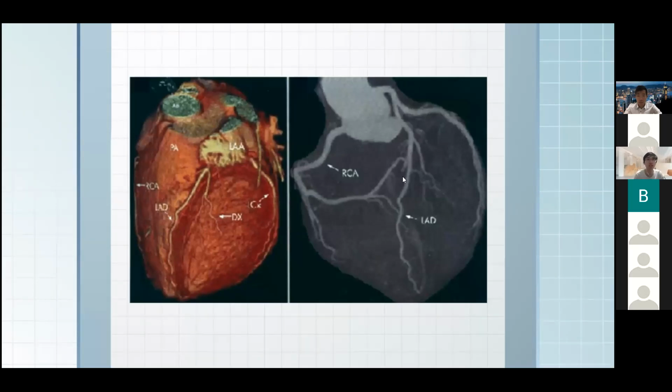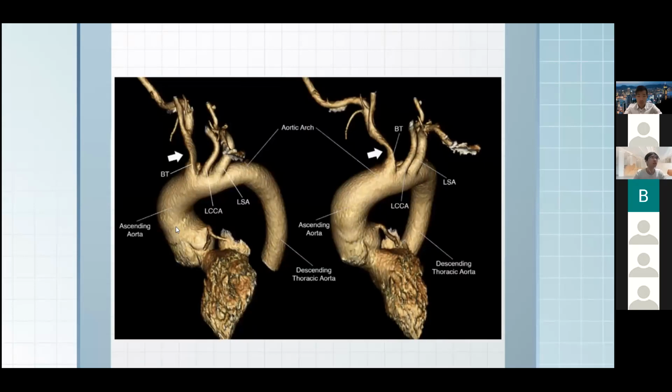This is a very commonly used, even though it sounds very new and sounds very professional, but it is a very commonly used technology for basically all types of CTs, as shown on the diagram on the left. So in terms of 3D reconstruction, modern technology has already allowed a very clear image of 3D reconstruction, such that we can look at the subarteries, like the branches of the three great coronary arteries themselves, in order to see whether the sub branches are also in danger, whether there is any stenosis, thrombus, etc.